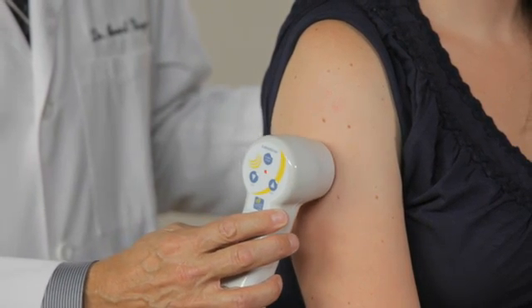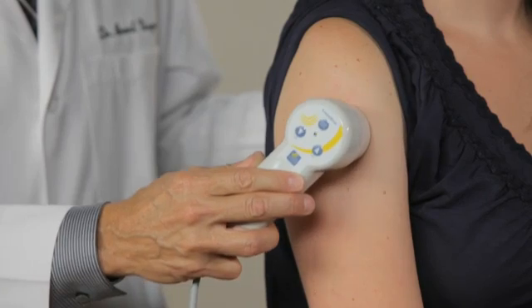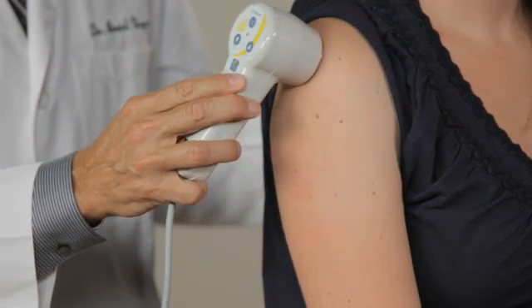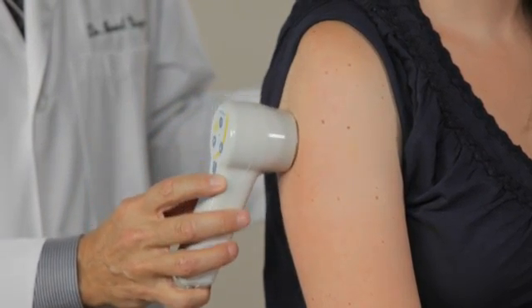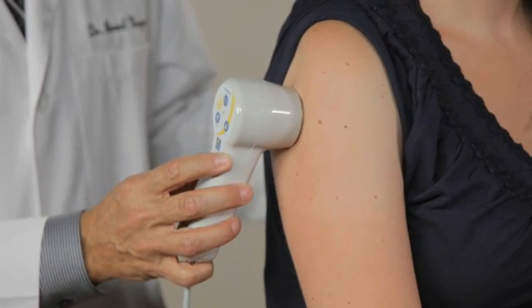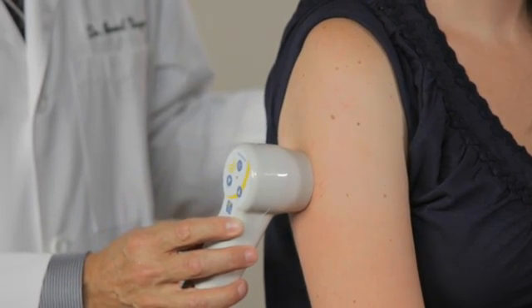We lift the head, reset it, and then start to scan slowly again, looking for other areas of clinical application due to the drop in impedance of the injured tissue.